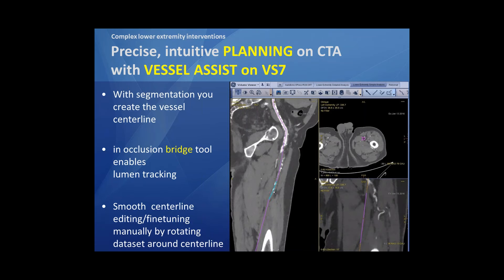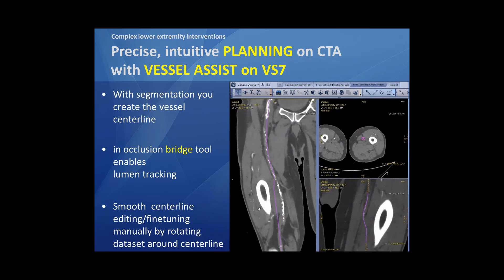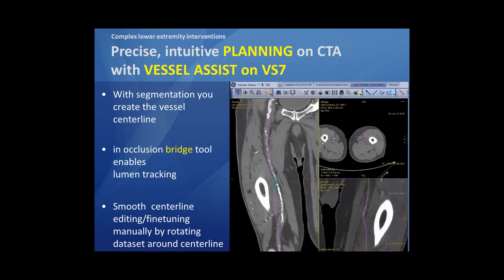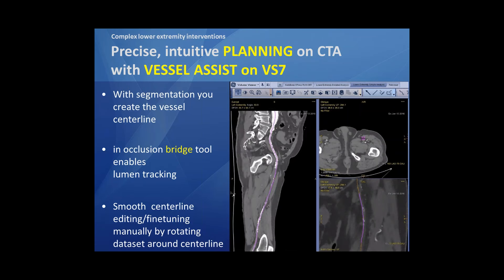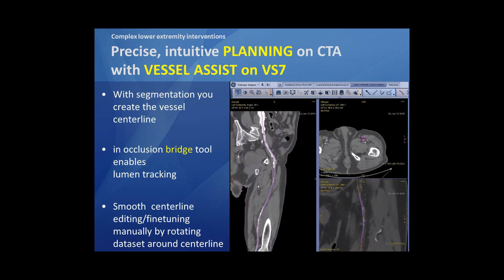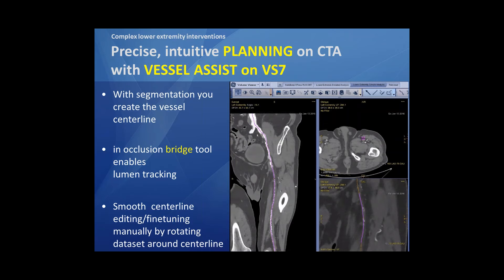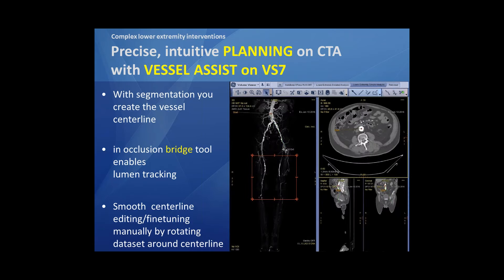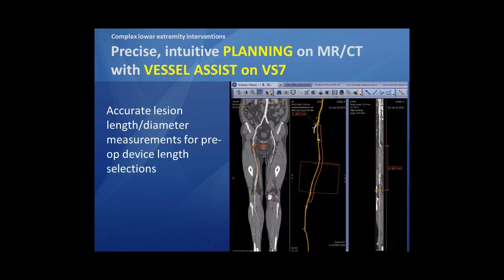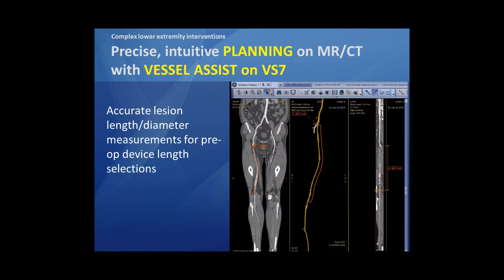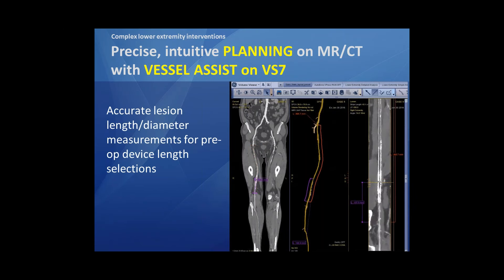As you can see, just based on calcifications, rotation, and translation, we can really adapt and re-edit the central line tracking until it's perfectly adapted. Another nice thing about having this central line is that you can create — just like in aneurysms — a stretched view, which you can see on the right.